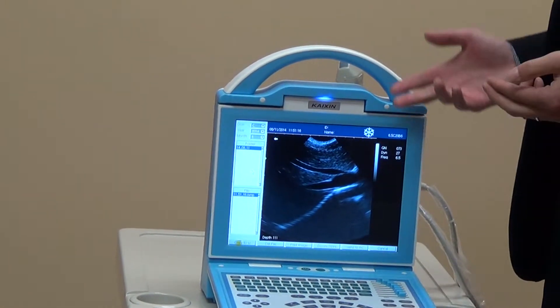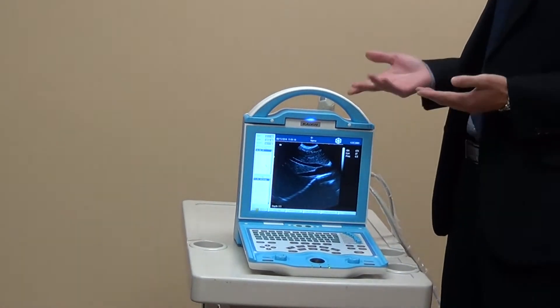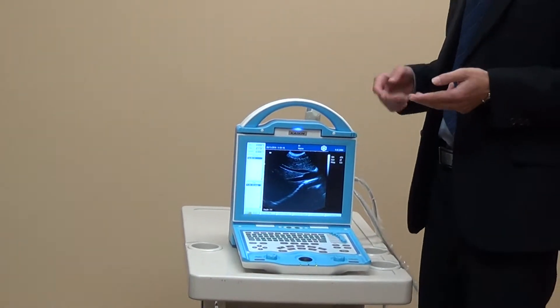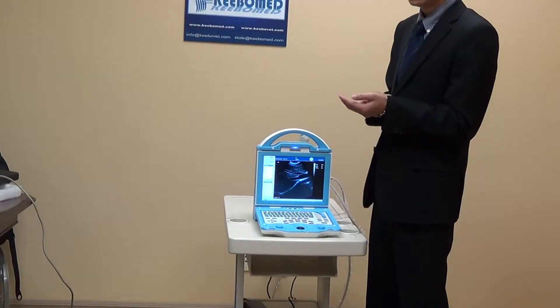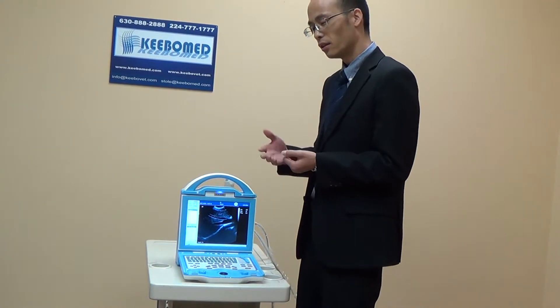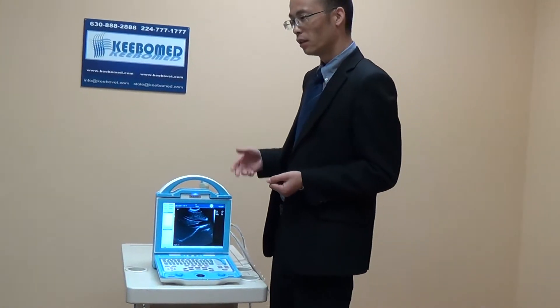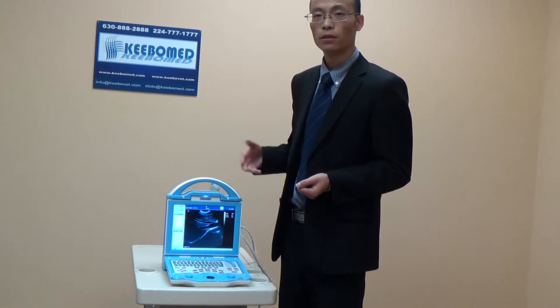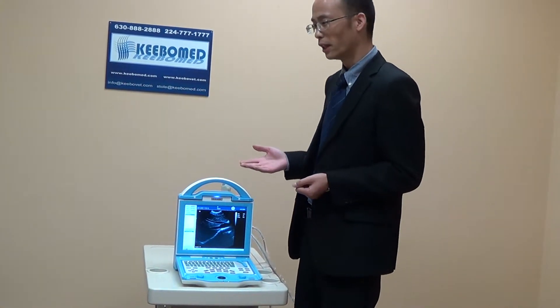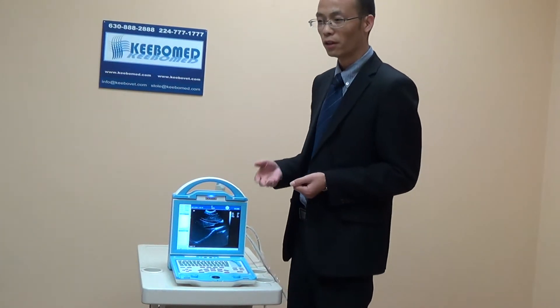The software operation of this main unit comes with multi-language support, including Spanish, Portuguese, English, French, Chinese, and Russian. It is very user-friendly, so you can select the exact language you are most familiar with.